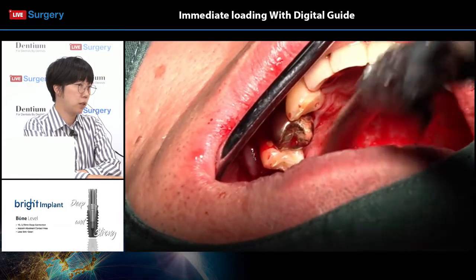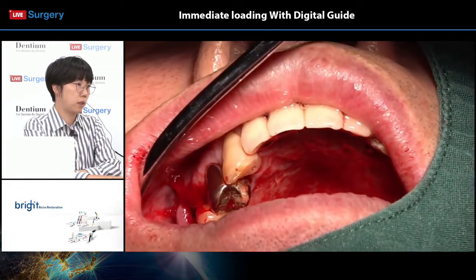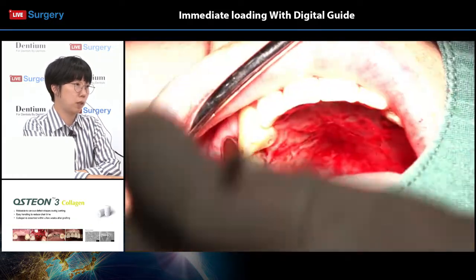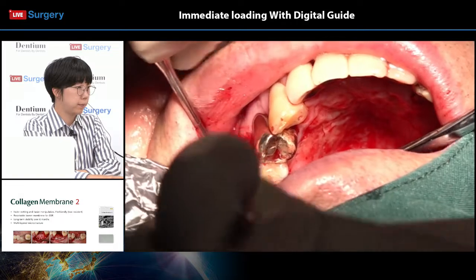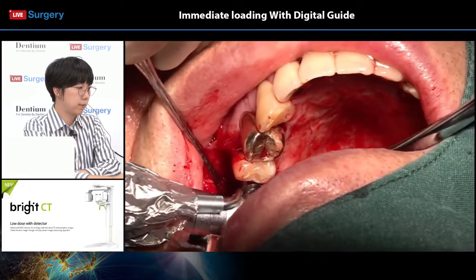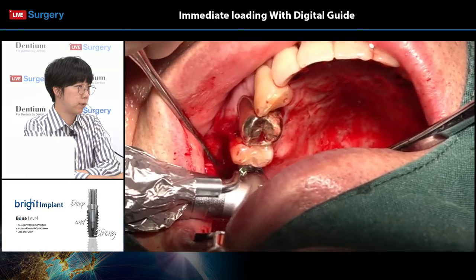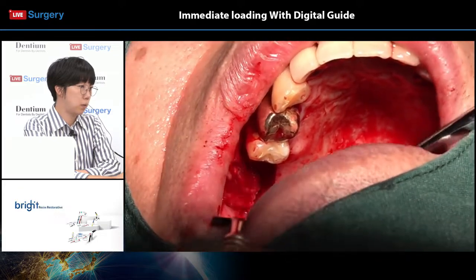I think the patient has some discomfort with breathing through only his nose. So in these cases, the surgery can take a little longer compared to people who are comfortable with breathing only through their nose. Dr. Lee is now securing the implants into the wanted positions.